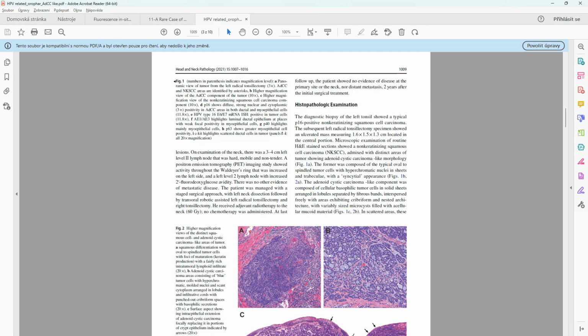To make it even more complicated, you know what we received from the molecular lab, a CYLD gene mutation. So there is no fusion, there is a CYLD gene mutation, and of course this HPV, and negative staining for MYB, and MYB FISH is also negative. So my final diagnosis is squamous cell carcinoma of oropharynx, HPV related, looking like adenoid-cystic or with adenoid-cystic-like features.